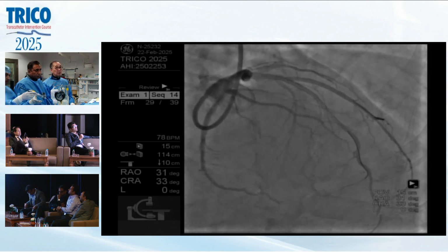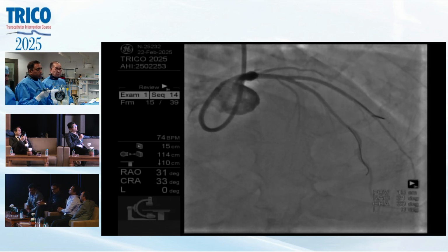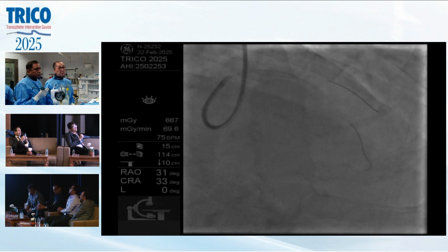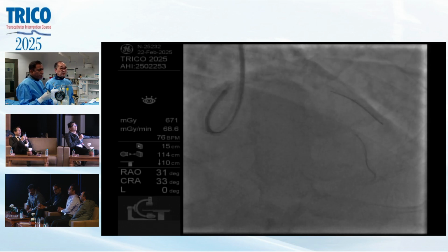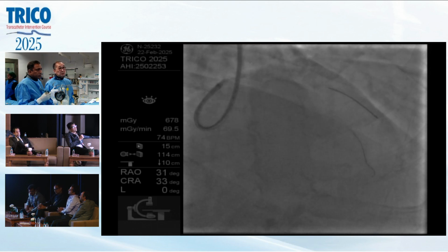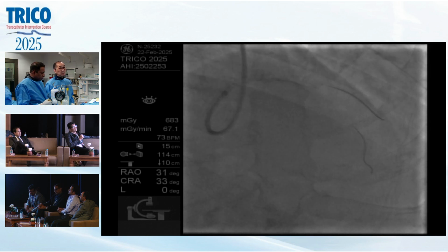I mean, this one is only 8 millimeter, 8 to 10 is okay. But if you jail a long one, you should take it out. When you jail 20 millimeters of wire underneath the stent, it's very difficult to get out sometimes, with a lot of calcium, and there's a risk of breaking the wire. So in that case, I will take the jailed wire out.